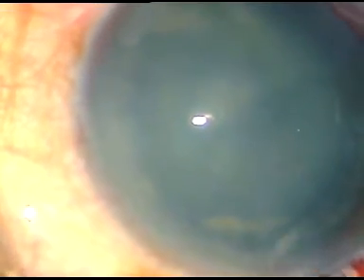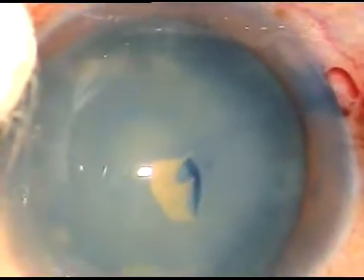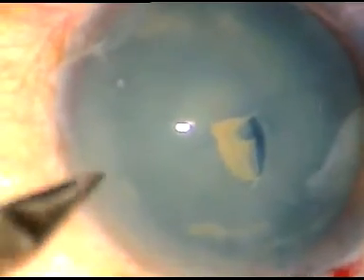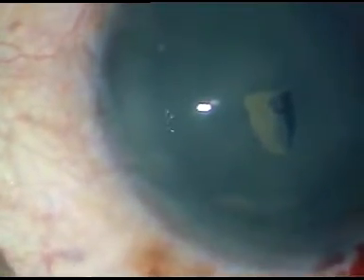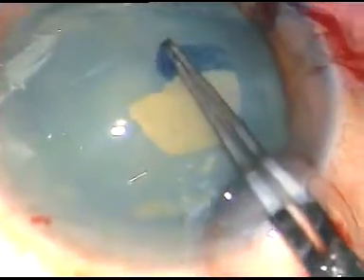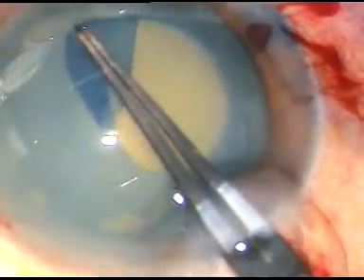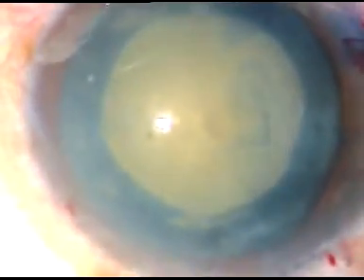Another side port is made on the left side of the main incision. And now this is how to do capsulorhexis. In this case, since this is a non-intimescent cataract, I am going to do rexis at one go — meaning adequate rexis at the first attempt. Just tent the anterior lip of the main incision and leakage of viscoelastic substance will be negligible. Rexis is done.